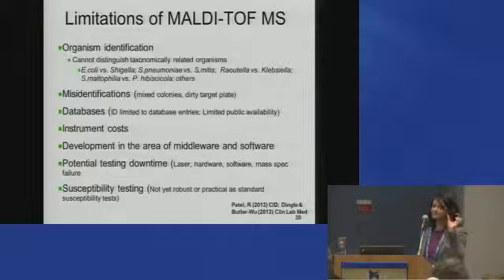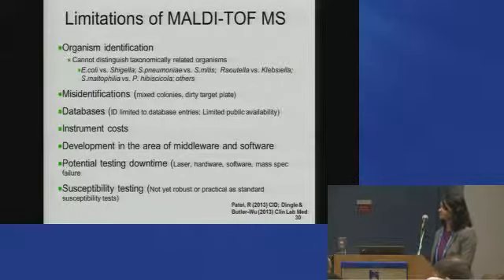And we use the word preliminary till that actual crossover occurs and so on. So now that there is FDA approval with the Bruker, with some of the organisms, I think Siemens is now motivated and wishes to try to help us get that software, the middleware, going.